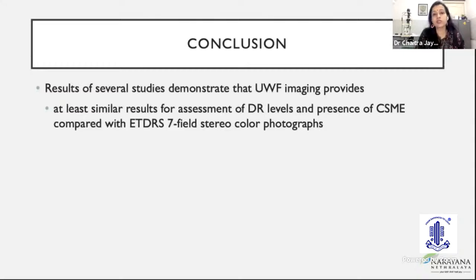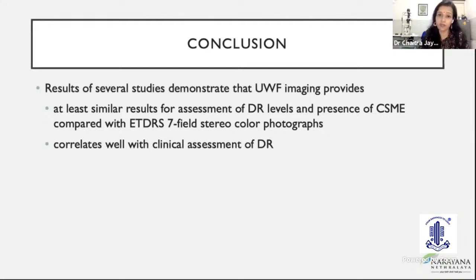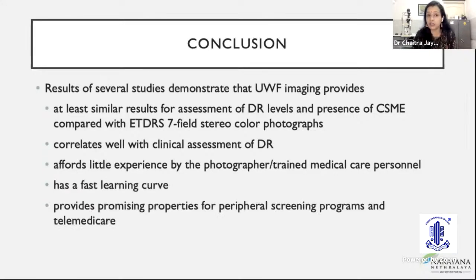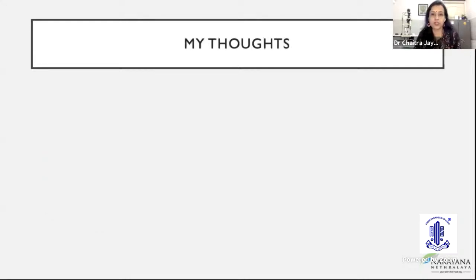So to conclude, the results of several studies have shown that ultra-widefield imaging does provide similar results to the ETDRS 7-field color photograph. It correlates very well clinically as well. Little experience is required for imaging, and it can be done by a photographer or by medical care personnel. There's a fast learning curve. It has promise for peripheral screening programs and telemedicine as well, because it's very quick. And it can be done even in non-cooperative patients.